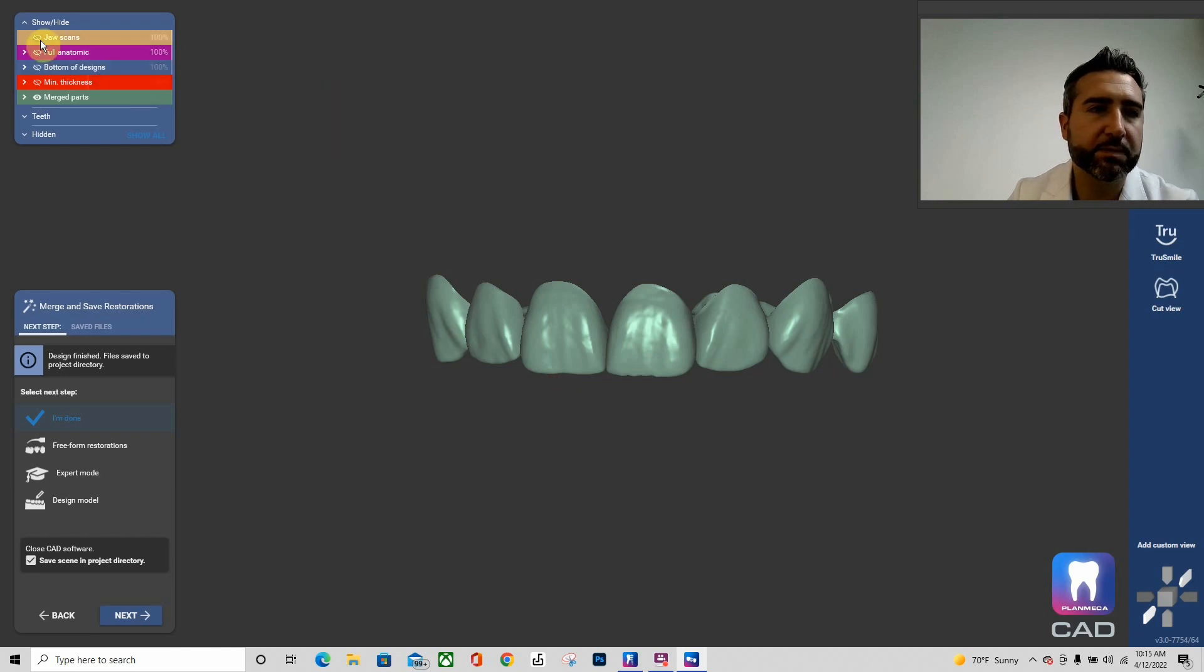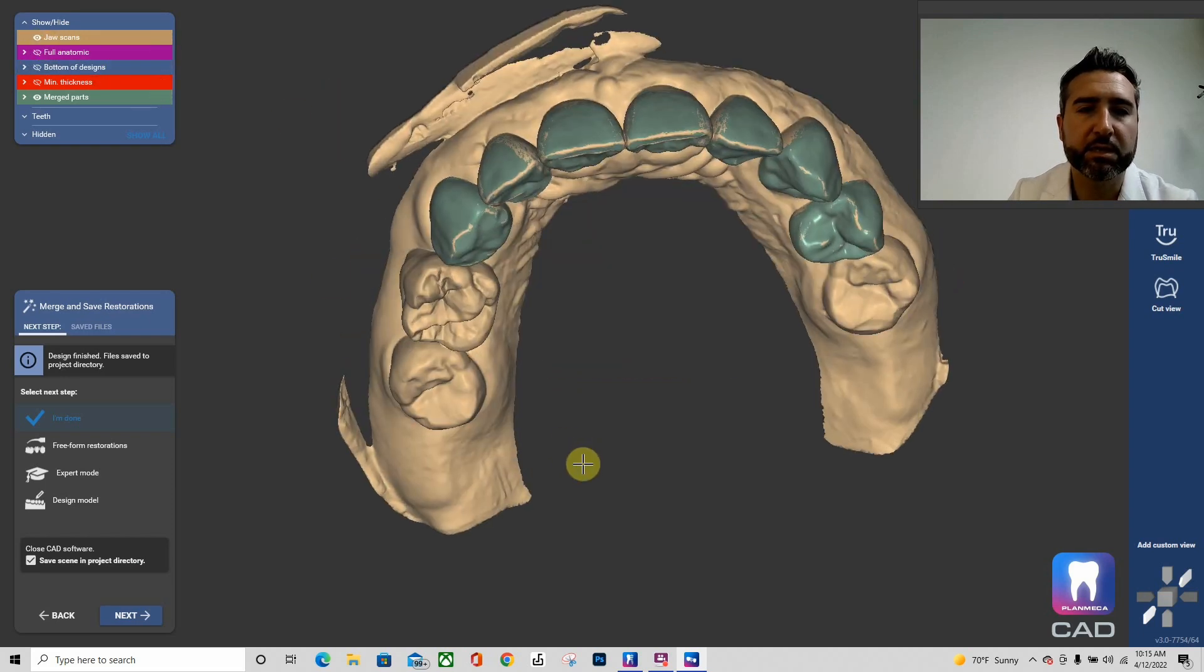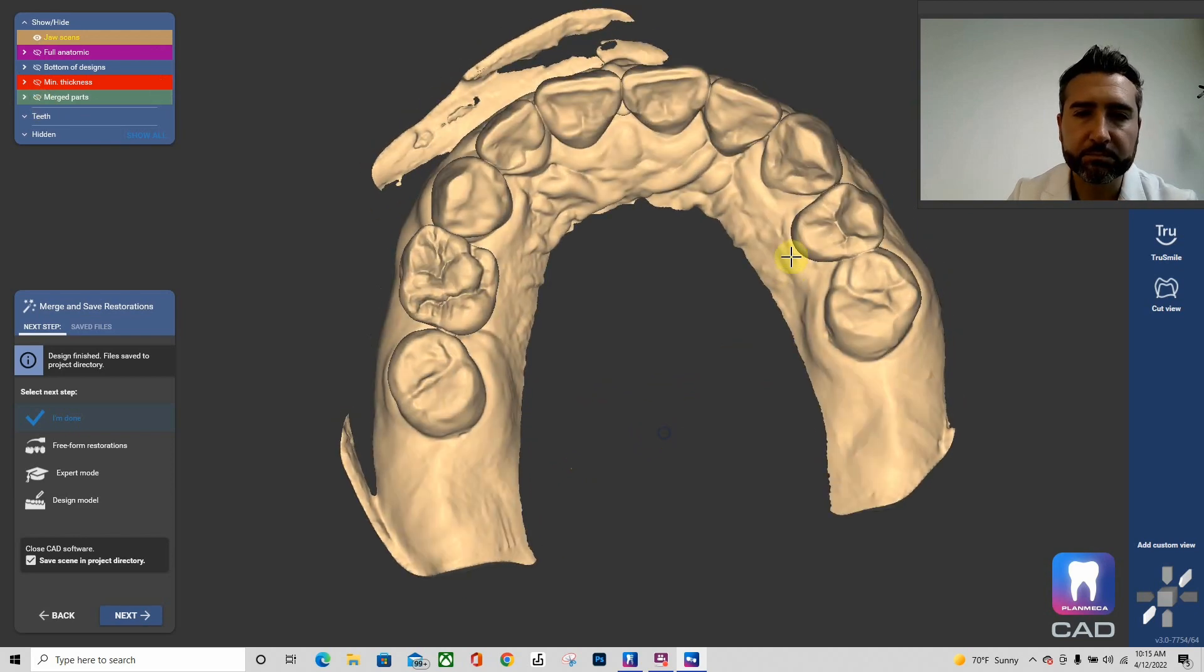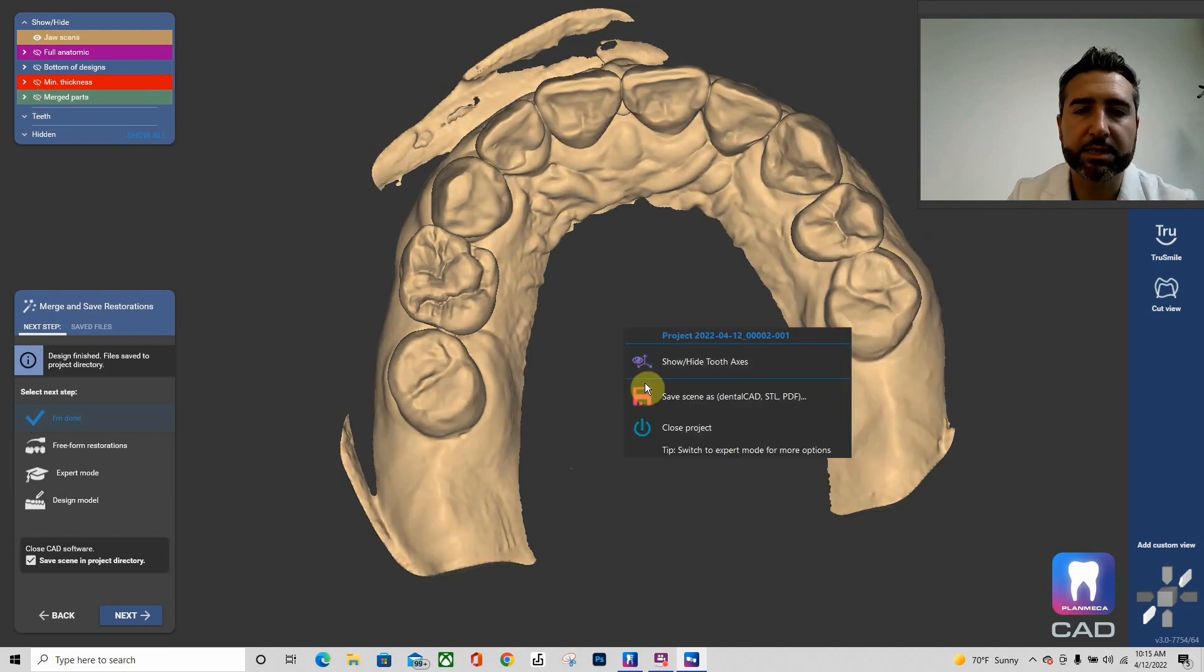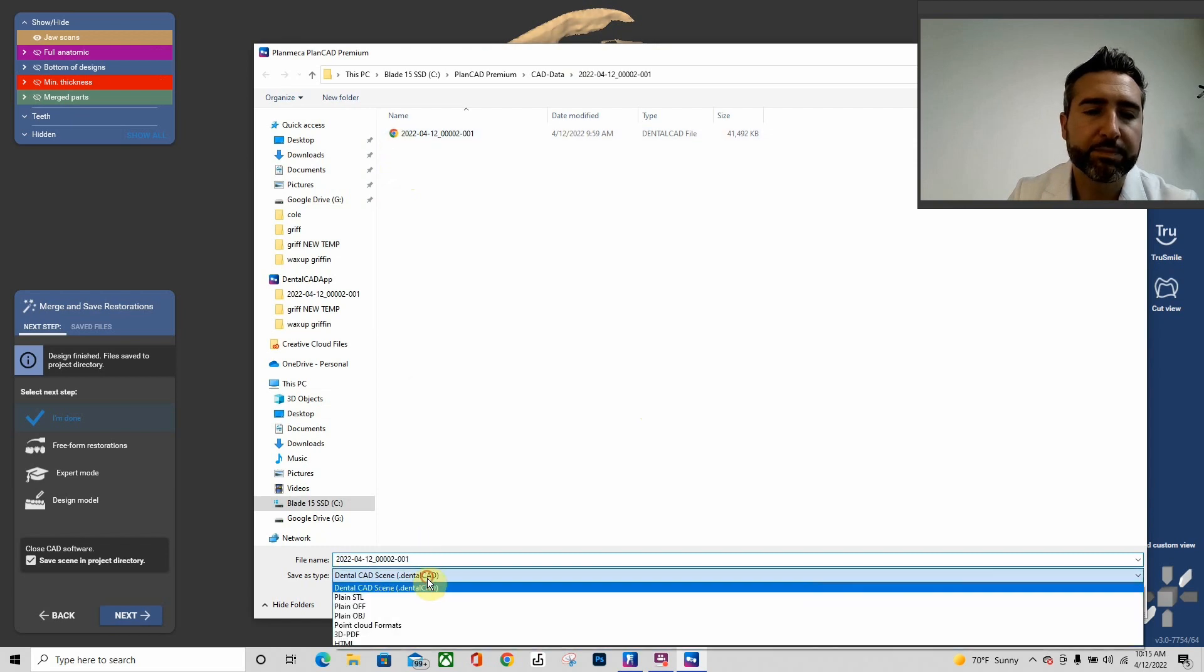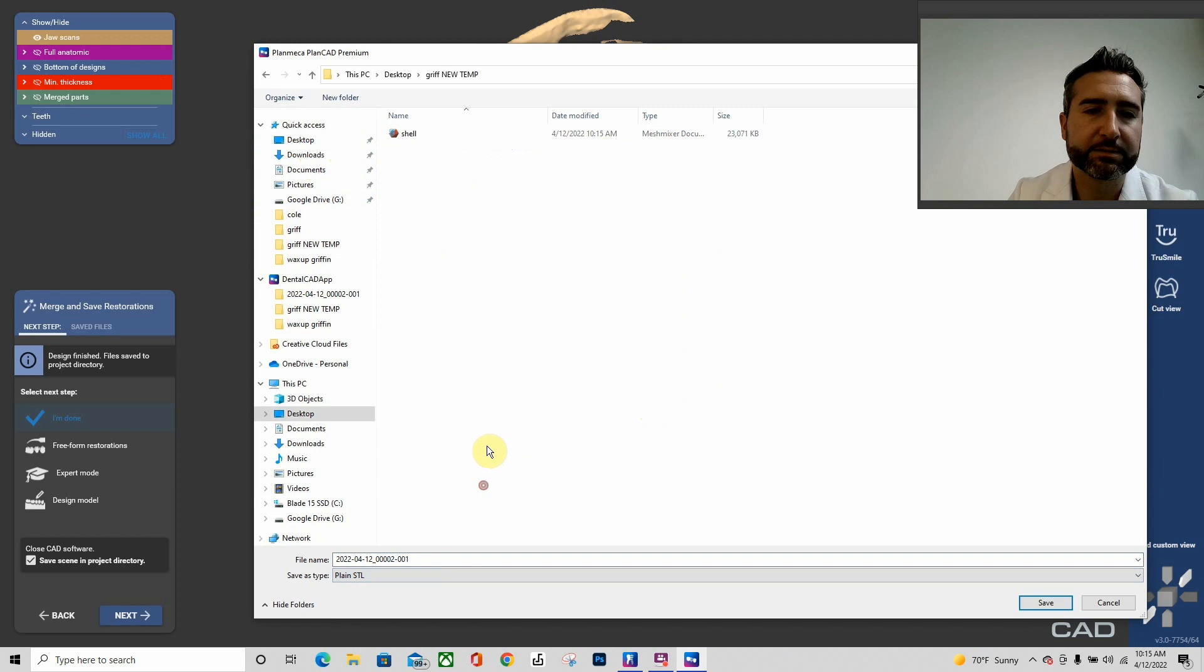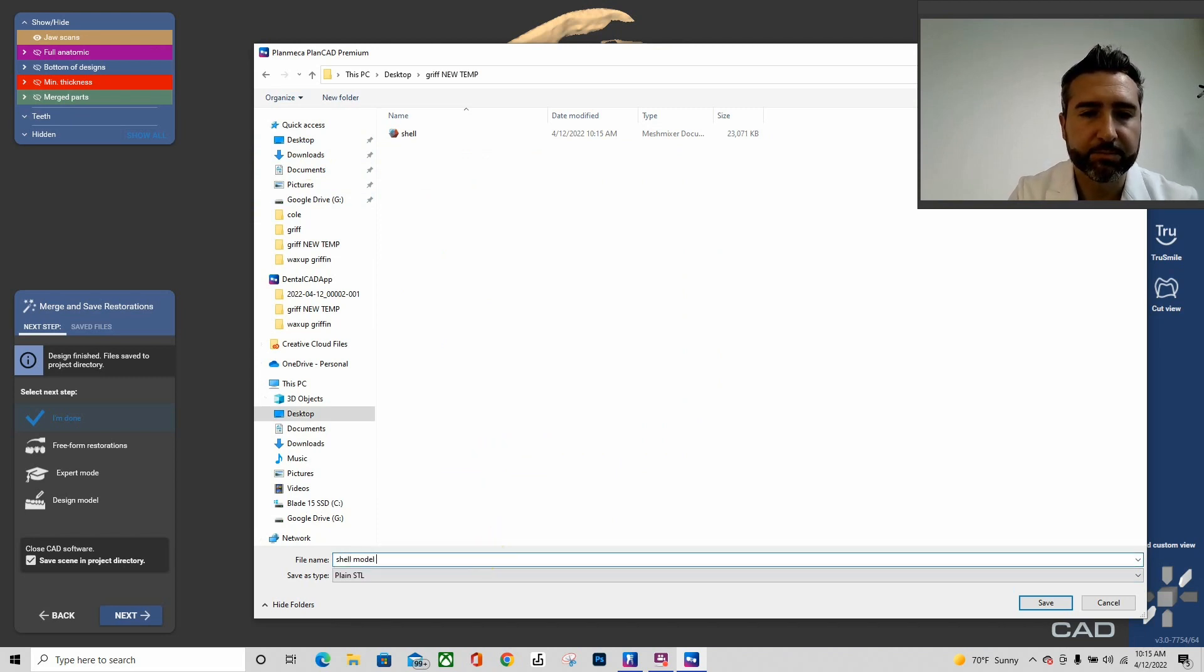I'm going to right-click and hit save scene as plain STL. And then I'm going to actually bring on my jaw scan here, and I'm going to turn off my shell. I'm going to right-click and save scene as plain STL. I'm going to call this shell model. There we go.